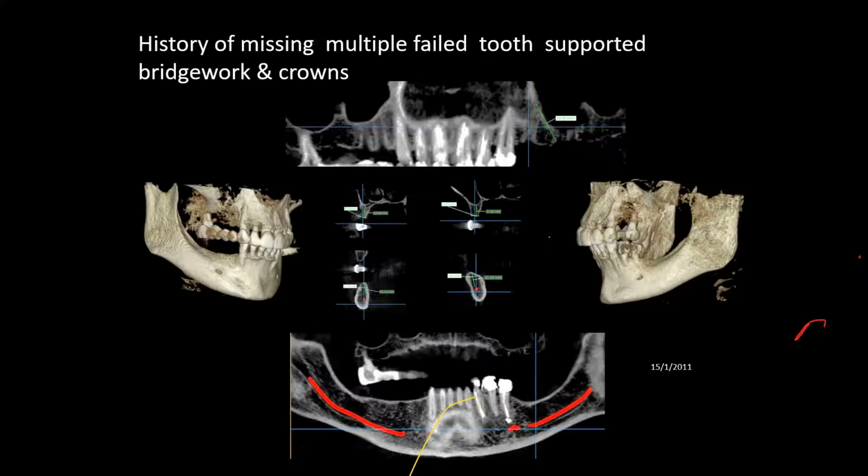But when you look at this case, let me assure you that we have adequate room for placing implants on all segments that you wish to do. And you can see there's an image of a provisional bridgework in place on both sides of this patient, and some provisional crowns have been placed. We remove the residual teeth to allow bone regeneration while maintaining patient comfort. So I've given you a couple of dimensions which will help you to assess exactly that there's adequate bone for this patient.